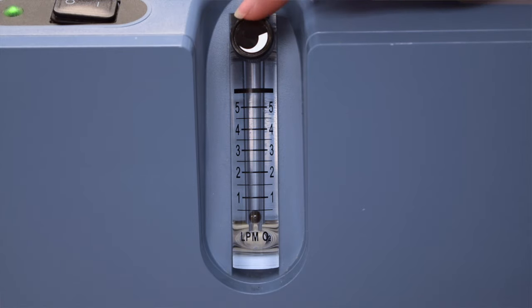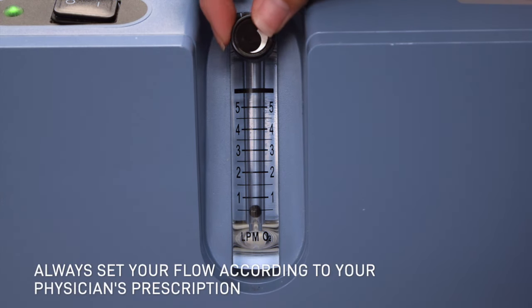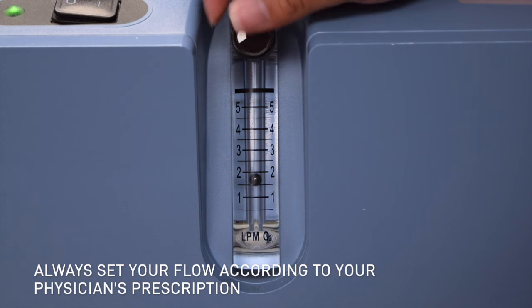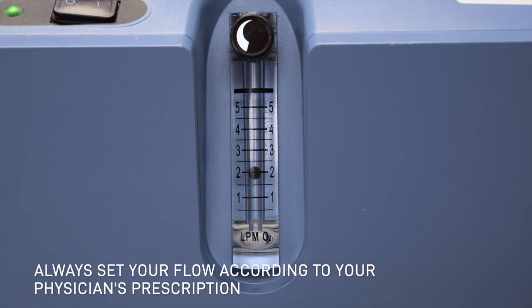Here we have our flow meter. At eye level, turn the knob to center the ball onto the line of the prescribed liter flow per your provider. Here you can see the ball is exactly in the center of two liters.